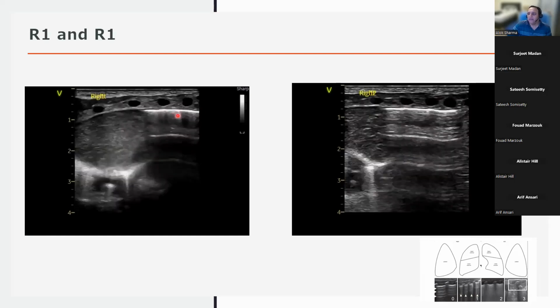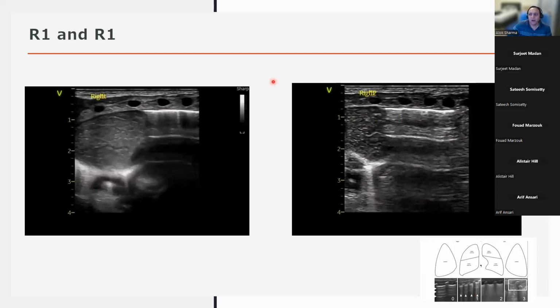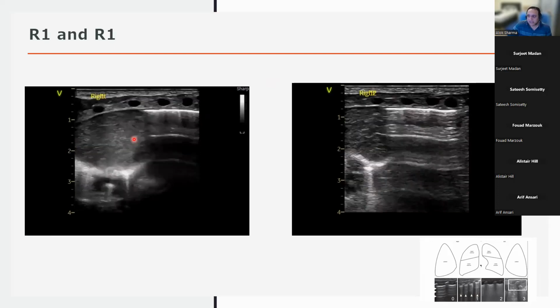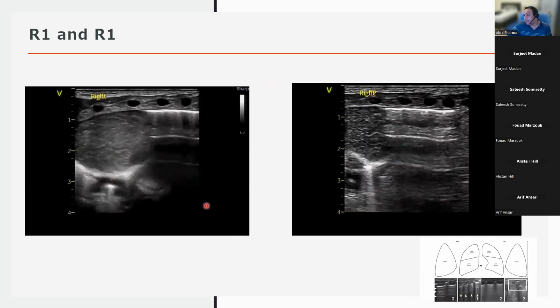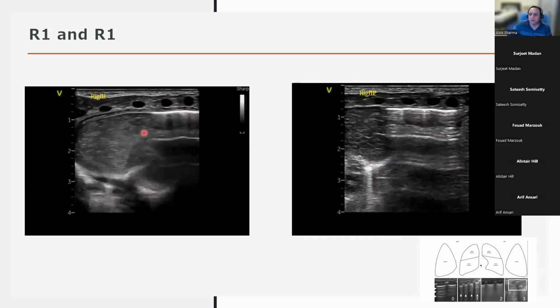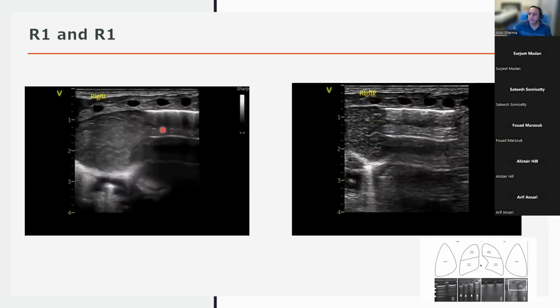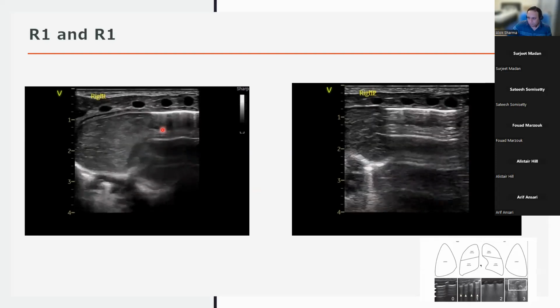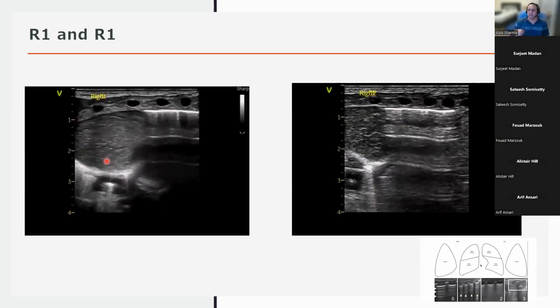You've got these comet tails. Any B-lines? No, not seen. Okay, what's this? Anybody? Thymus. Yes, it's thymus. So in terms of exposure down to 4 centimeters, a nice, smooth, regular pleural line with comet tails, some A-lines, classical A profile. Normal, abnormal? Normal. Beautiful.